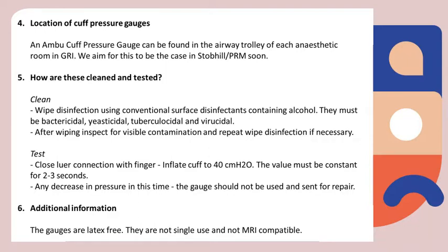To test it, occlude the lure connection found at the side of the manometer, inflate the cuff to a pressure of 40 cm of water, at which it should remain constant for 2-3 seconds. We suggest testing this weekly. If it does not stay at 40 cm of water, do not use the manometer and please send it for repair.